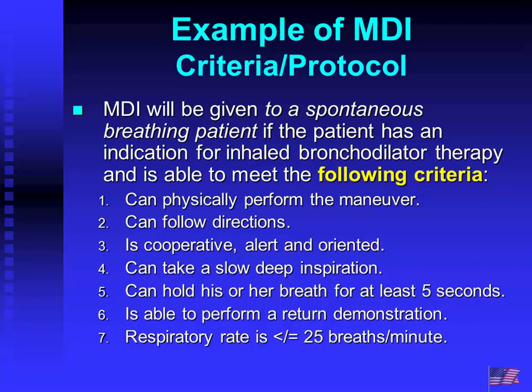So these are the requirements of who can do an MDI. And again, that's part of the problem, is they need to know how to follow directions. They need to be alert. They have to be able to take a slow breath to a maximal amount and hold their breath. And they have to do the return demonstration in the process.